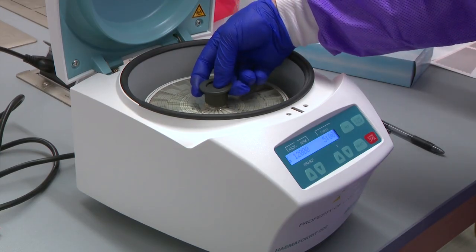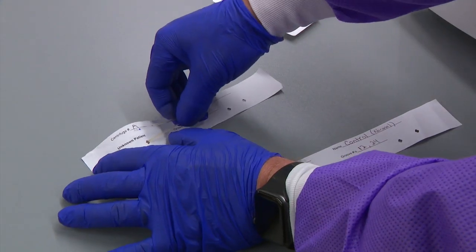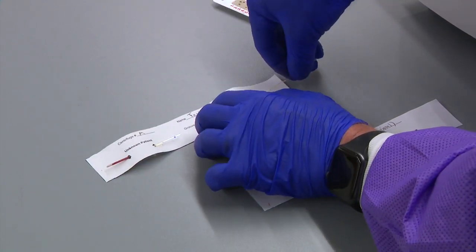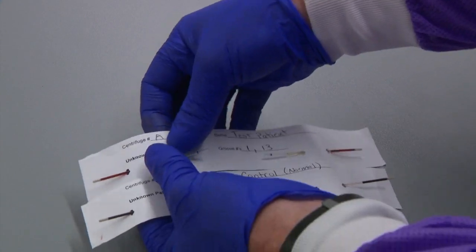After centrifugation is finished, remove the micro hematocrit tubes from the centrifuge and place them back in the micro hematocrit tube holders in the correct holes. Transfer the sheet back to your workstation, making sure to hold the tubes and sheet.